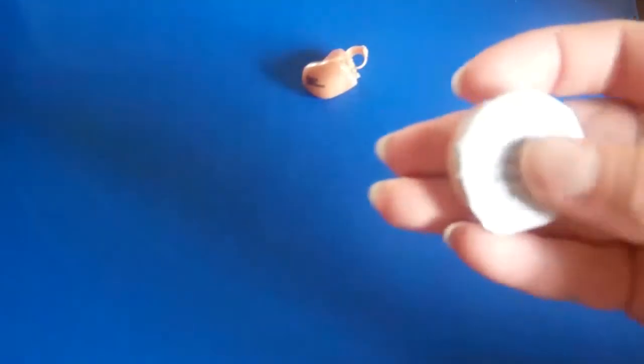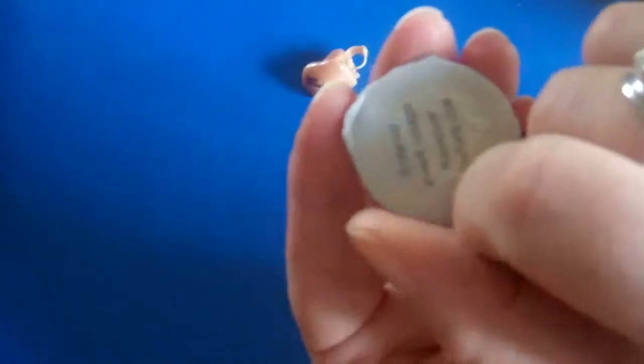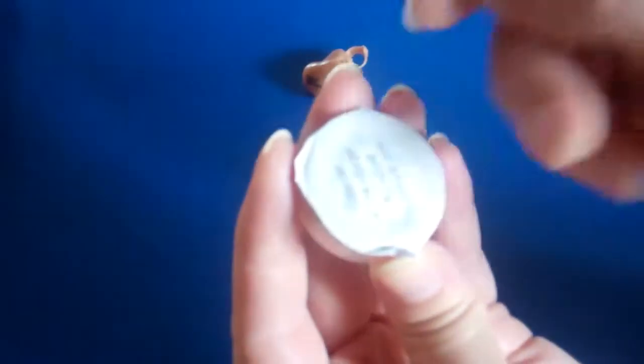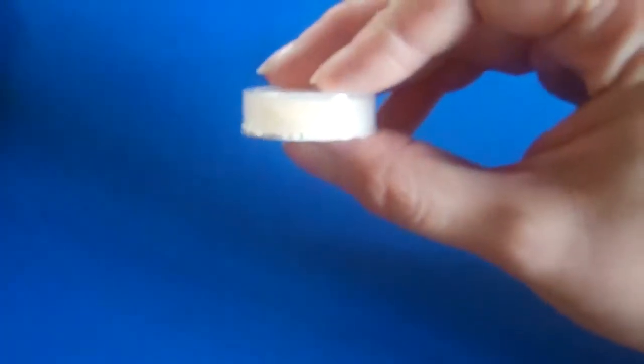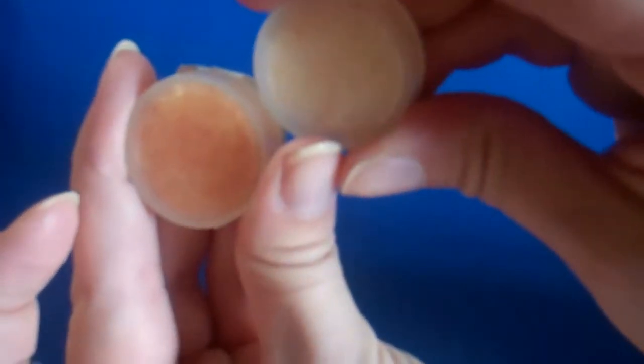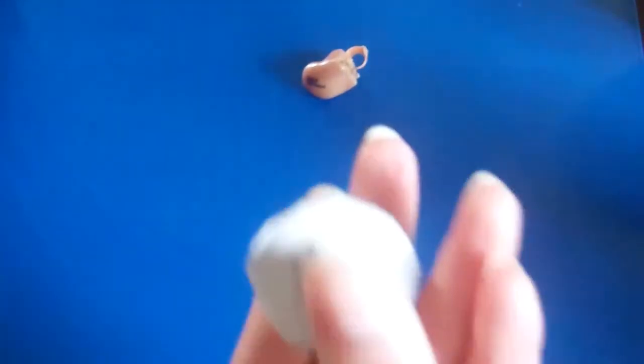Now, the little piece in the bottom, this little pellet, is replaceable. When you first get it, it will be a dark orange color, like so, and it will have a little foil cap on top. In order to activate it, you're going to peel off this little foil cap, and then you're going to see underneath the top that looks like this. You can write on it what date you peeled off the cap, because the pellet lasts anywhere from 3 to 4 months. It will change from a dark orange color to a clear whitish color when it is ready to be done. When it's finished, you throw it away and put in a new one.